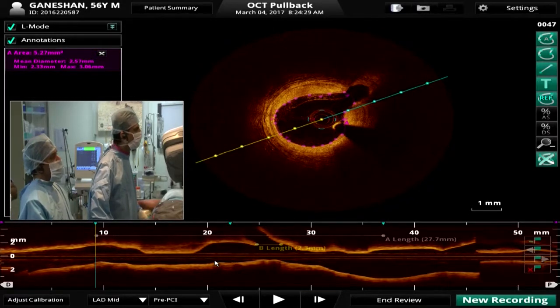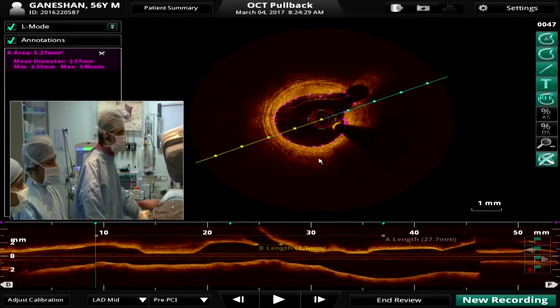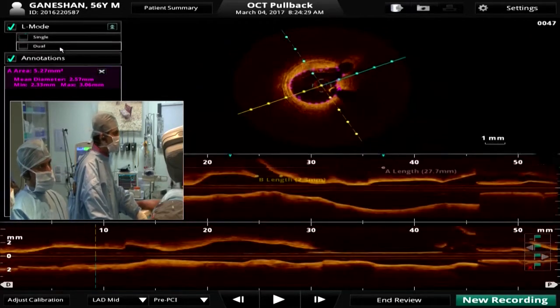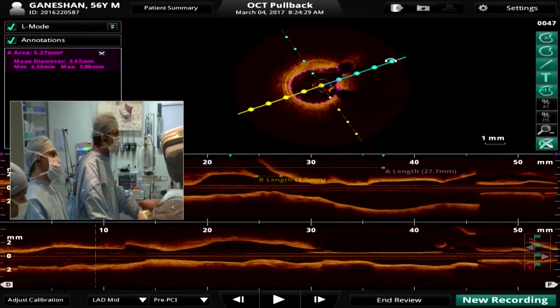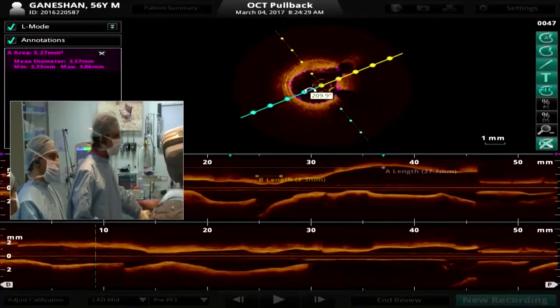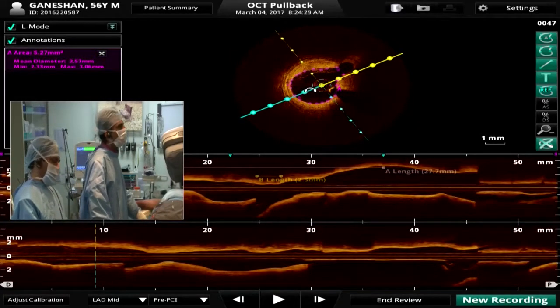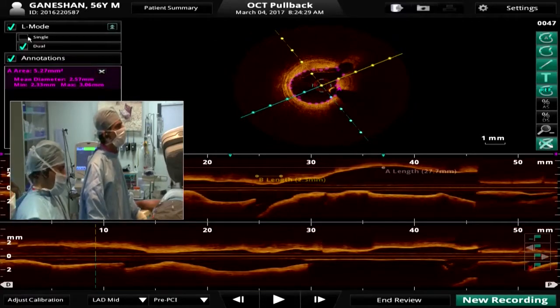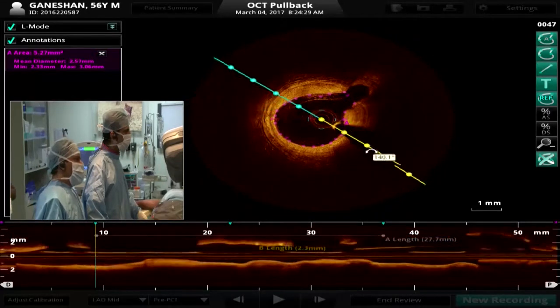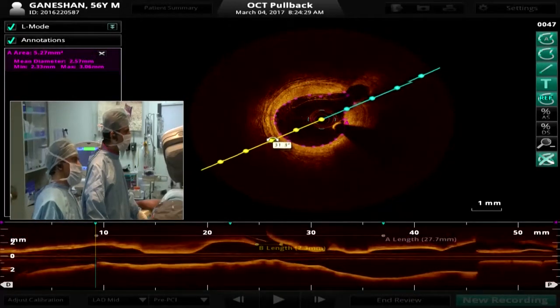And if we go by this principle, then any of the routine stents can expand up to 3.5 maybe. The only issue in that case is that sometimes if we implant the stent and then do an OCT again, we might find some malposition proximally. Then we need to expand it further, and we have the risk of over-expansion and causing injury to the polymer. What I intend to say is don't go to the region where it is 4. Why don't you land slightly distally?